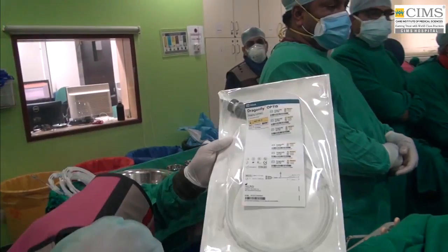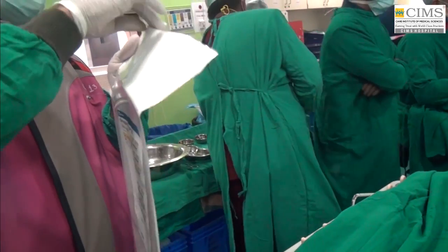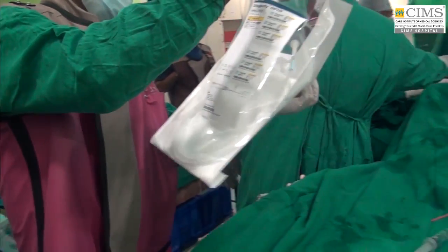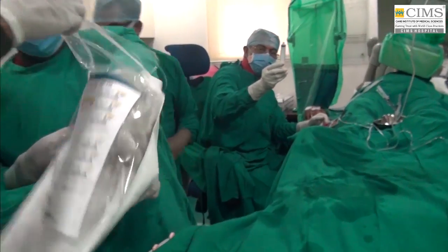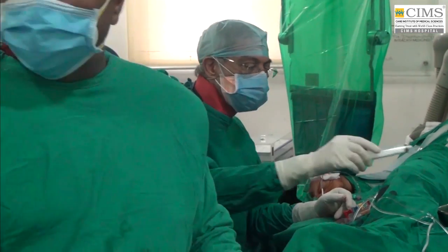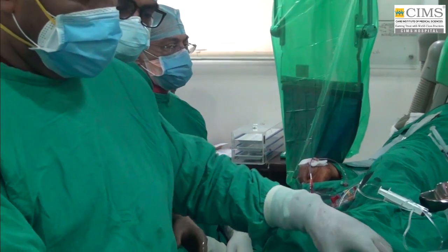Do you always pre-dilate before passing an OCT catheter, or only if the lesion is tight? When the lesion is tight, you pre-dilate, but we only open tight lesions. With the ISCHEMIA trial and many other trials, non-tight lesions have to be evaluated by FFR or physiologic testing.